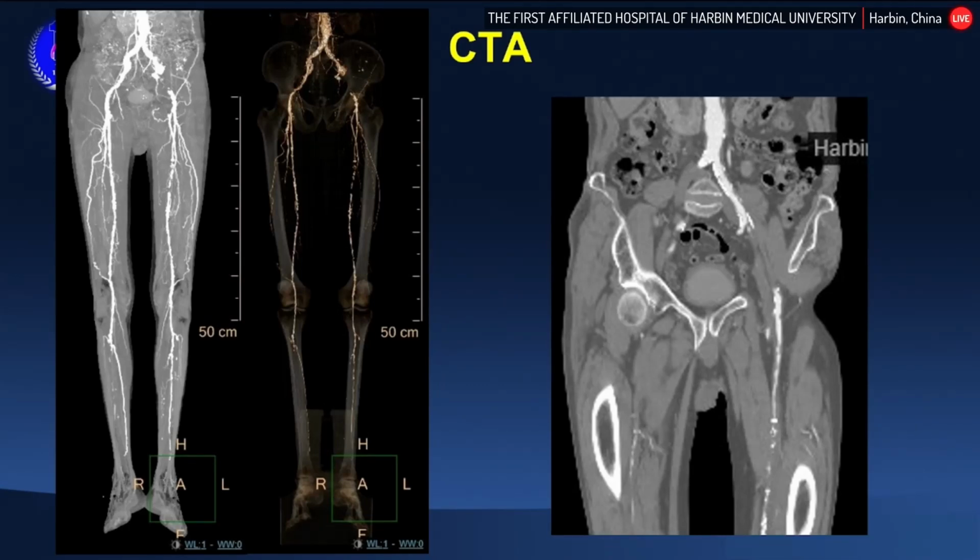So for this patient, after we discussed with the family, they decided to treat the iliac artery first, at least for this time. We can see the collaterals are building up very well, so we suppose that if we open the iliac artery, it will greatly relieve the symptoms. But if it's not working, we can try again to open the SFA next time, right? Yes. So I think this will be our strategy today.